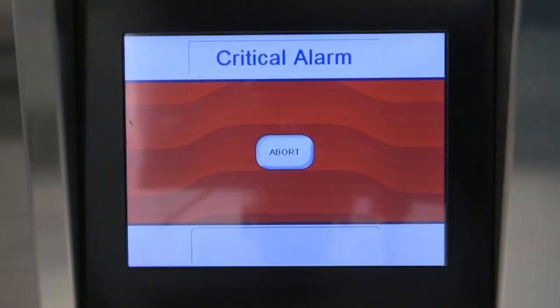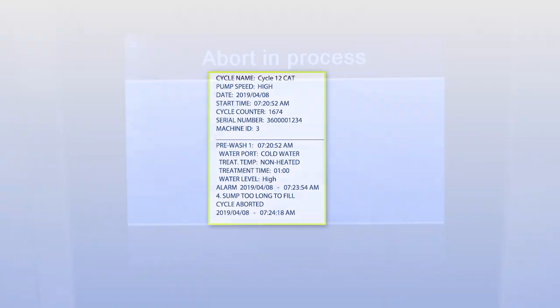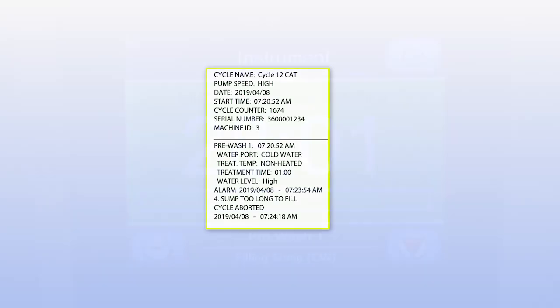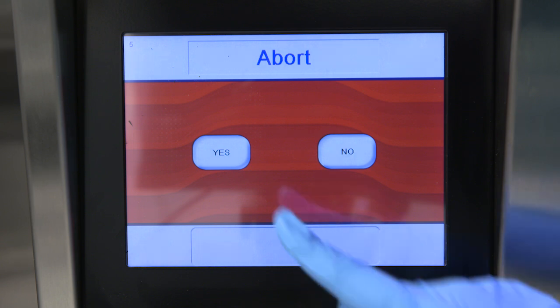If the alarm requires you to abort the cycle, press abort. The water is automatically drained and the control screen returns to ready mode. The cycle printout records the warning and alarm information and whether the cycle was resumed or aborted. If you need to abort a cycle without receiving an alarm, simply press stop, then abort.